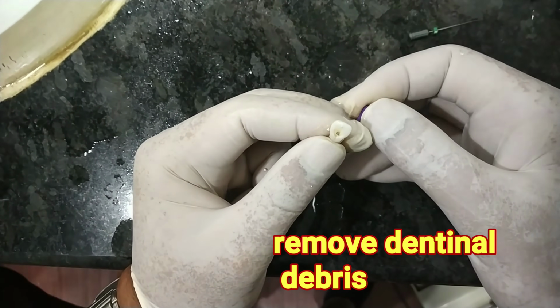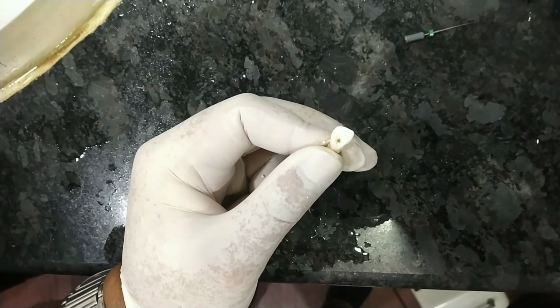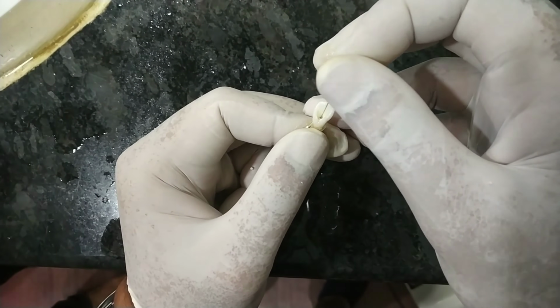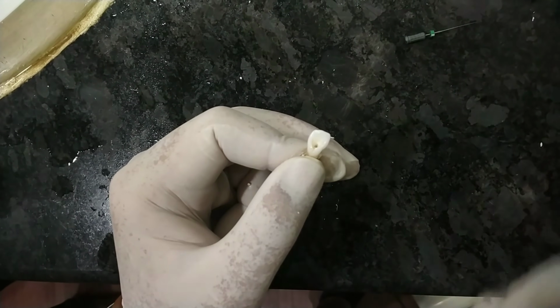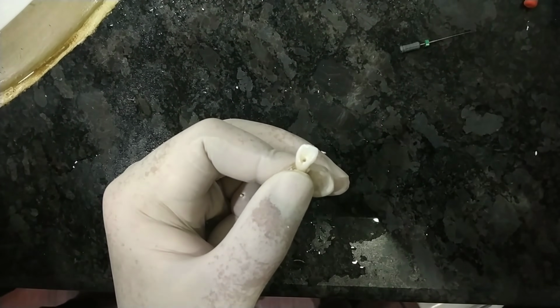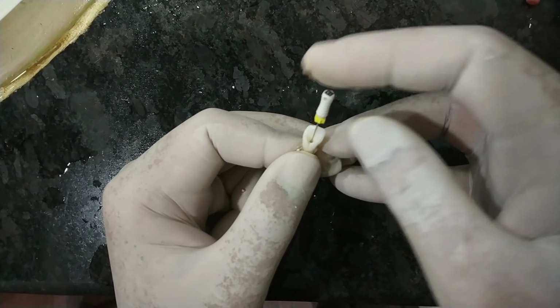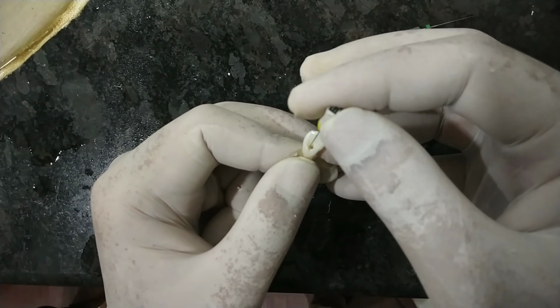So you insert it till the working length. Suppose the working length is 15 mm. So you have to set the working length at 15 mm and then insert it into the canal and file it in all the directions. Circumferential filing has to be done. After you file with number 10, next we are using the number 15 K file. Then you again insert till the working length of the tooth. Then you again file it in all directions.